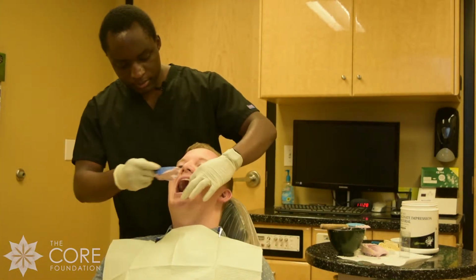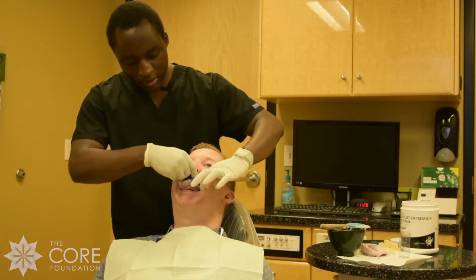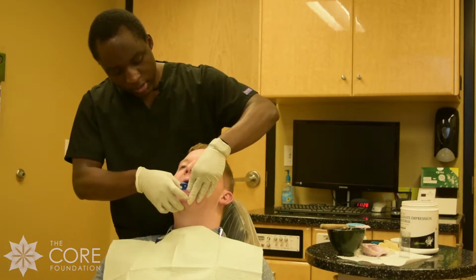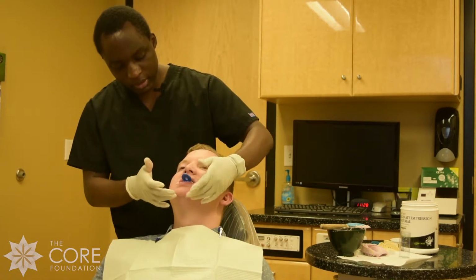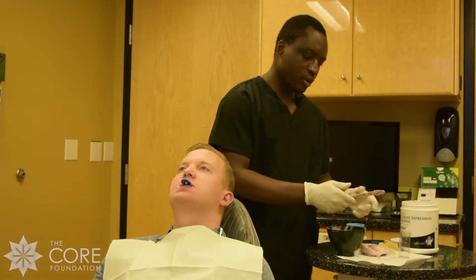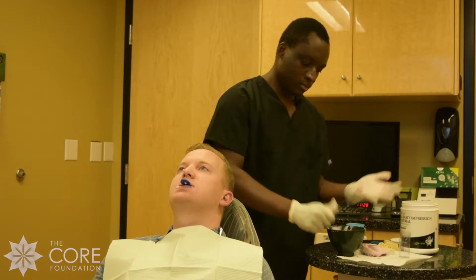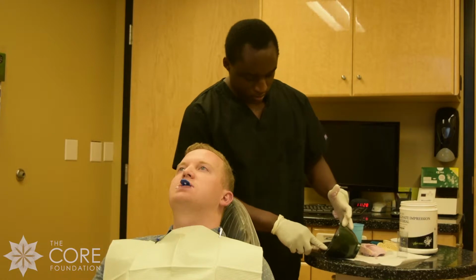Go ahead and open. All right. Retract the lips. Use this to retract the opposite side. Place it. Push down. And then have your patient bite down really hard. And then while we're waiting for this to set, we'll go ahead and clean. This way at the end, you don't have too much to clean.